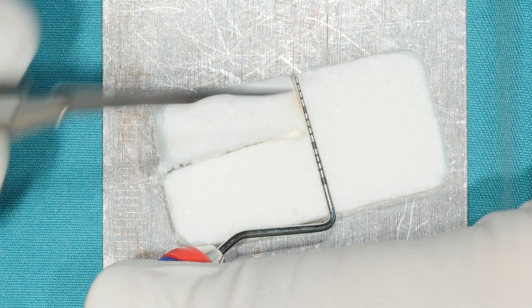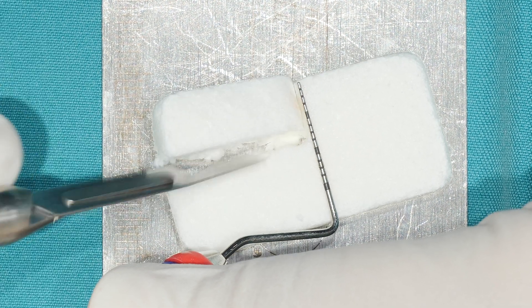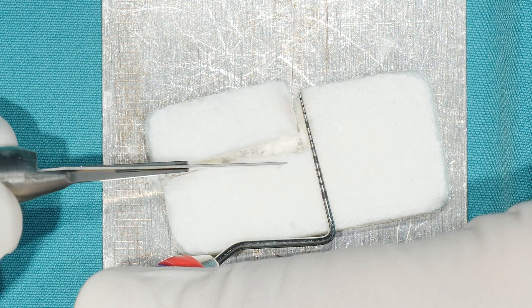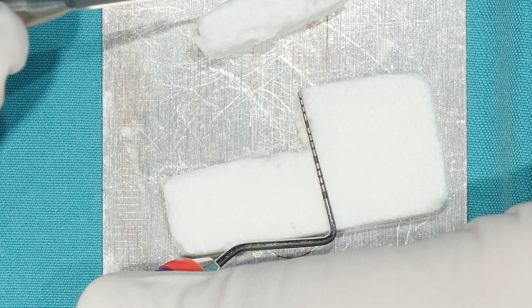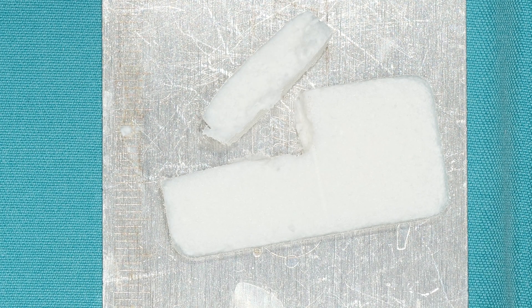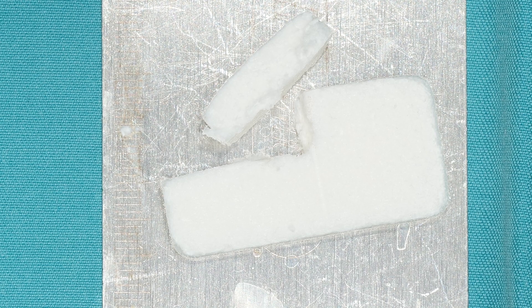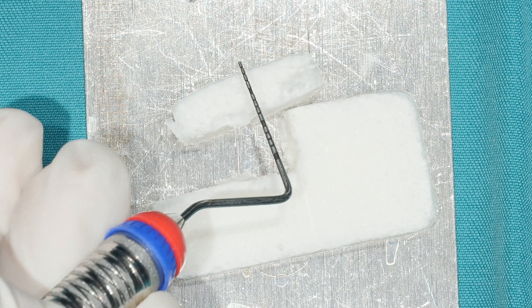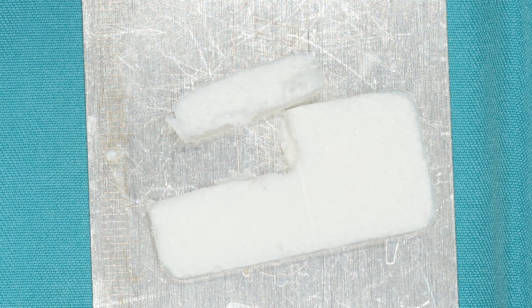This is one layer of cross-linked collagen, mainly collagen type one and three, but also with some small amount of elastin. You can see that if you have multiple procedures you can do them in the same day since you don't need to harvest tissue. In this case you can see we have six millimeters of thickness.